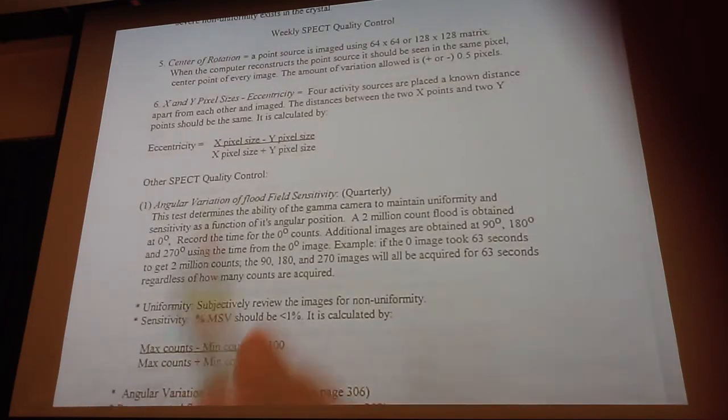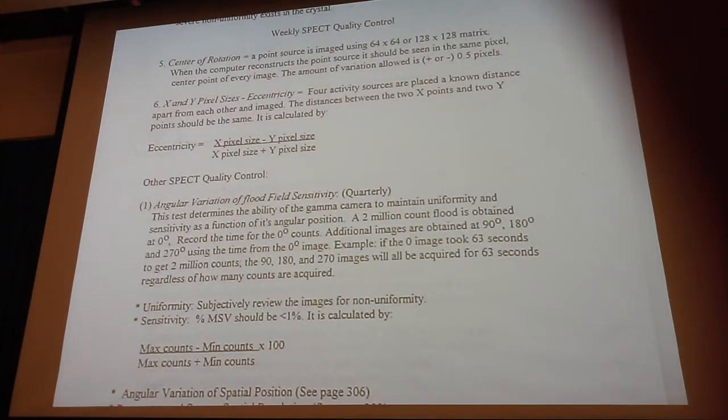Center of rotation. How many of you guys do center of rotation? How many of you have seen a center of rotation? You think so? That one, there's those 3 points in space and it goes around. Yeah. Well, actually, all you really need is 1 point in space. And so tell me about it.